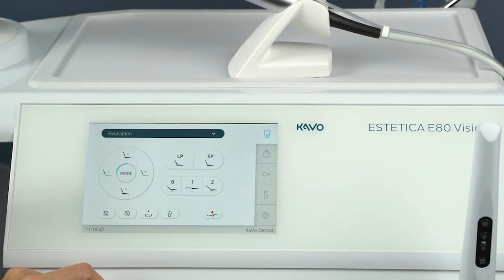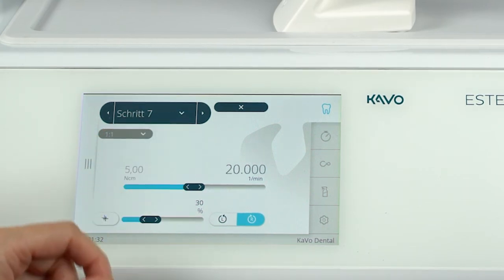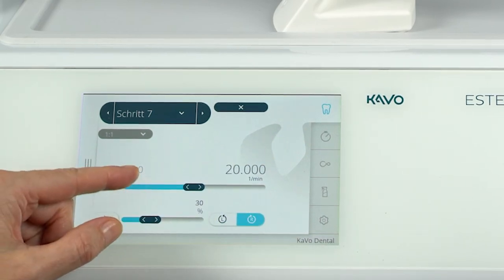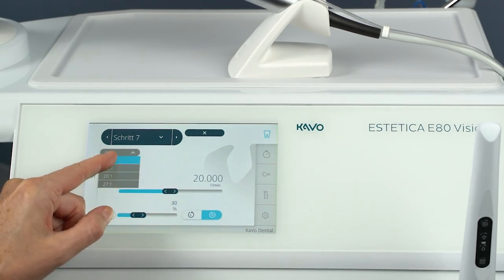All available values can be set in the free application activity. The following parameters can be changed: activity, maximum torque, programmed speed, coolant flow rate, transmission factor, and direction of motor rotation.